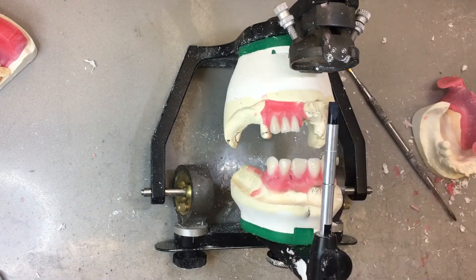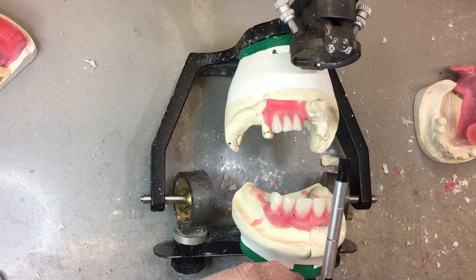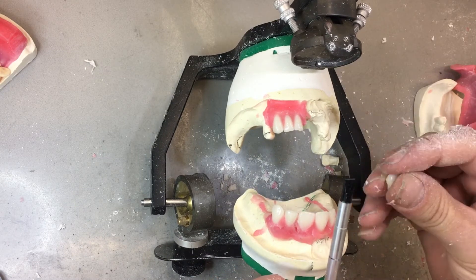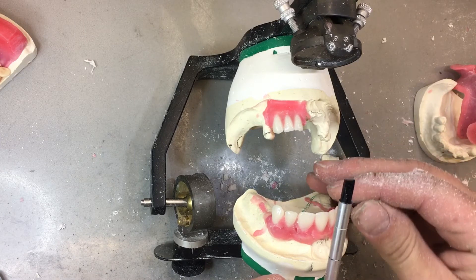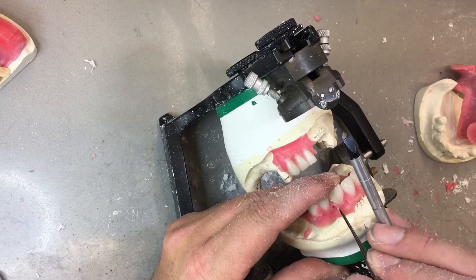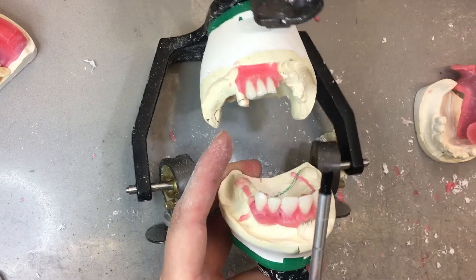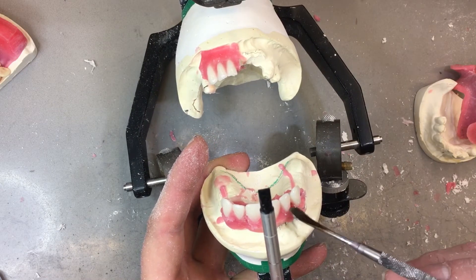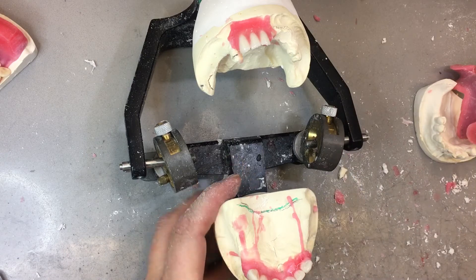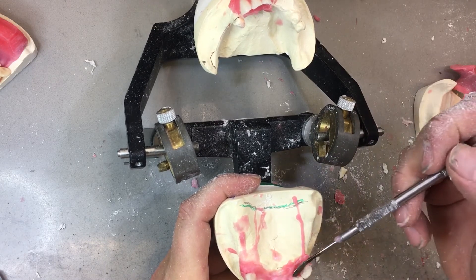The downside of immediate dentures — with this one in particular — there's no try-in. We could have tried in the posterior teeth only to assess the shade and the vertical dimension, but there's no try-in, so there's no redo chance. There's no catching that the midline's off, no catching that the shade is off — it's got to go. That's why some treatment plans call for wearing the temporary denture and fixing all those things later. But if we're doing a good job, it'll go straight forward.